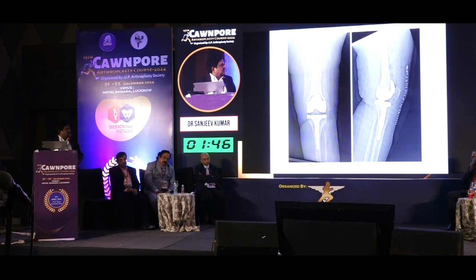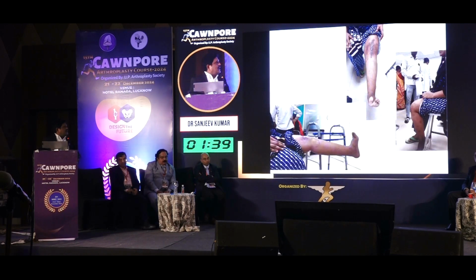So we closed this knee, and this is how we got the post-op X-rays. After almost 3 to 4 months of this surgery, the patient has 0 to 90 degrees of flexion. She is pain-free now and a happy patient.